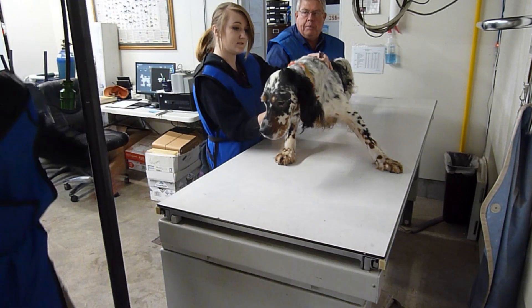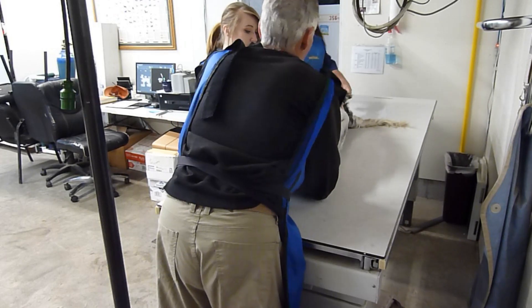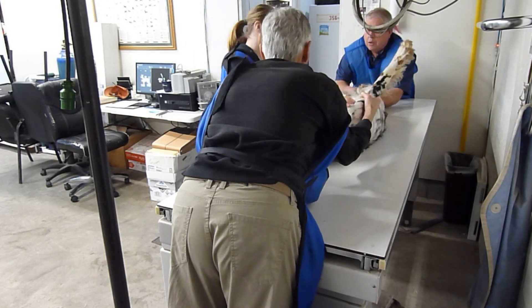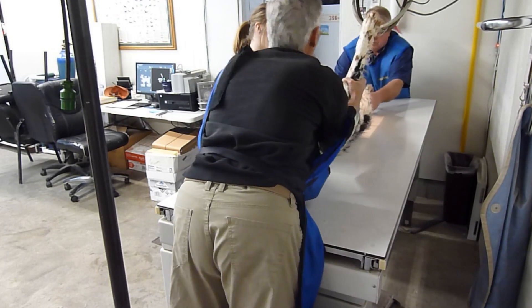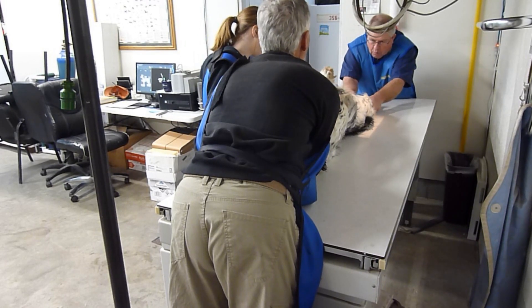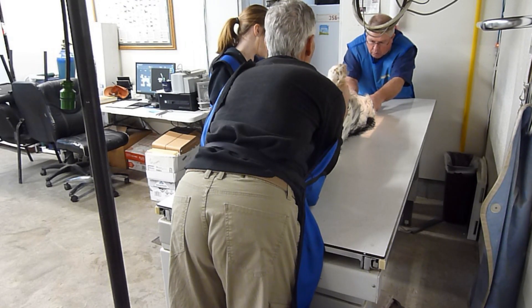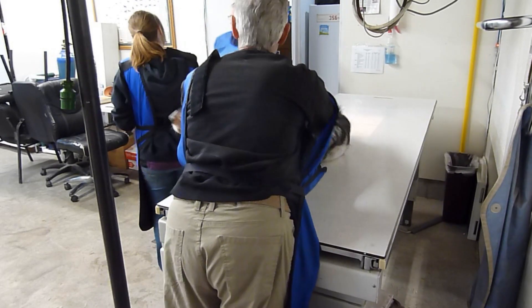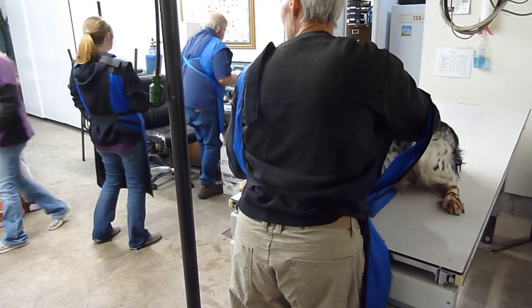I'm going to get around the end of this. Is he chipped? No. We're going to check on them. Turn on the light, please. Push his chest away from you slightly. I hate it when he arcs their back, right or left. That's what throws them, because it throws their pelvis. We've got a nice brawny today, Paul. Good.